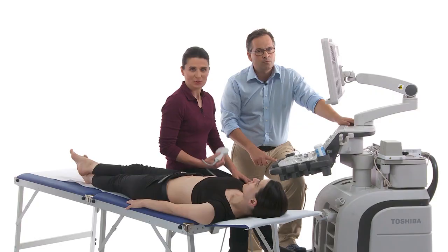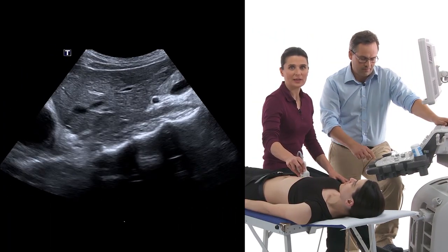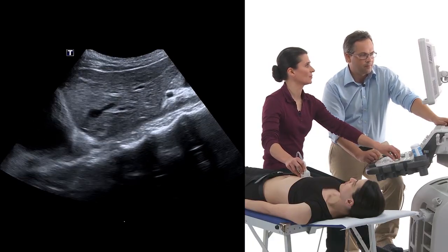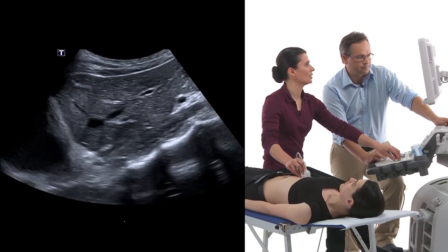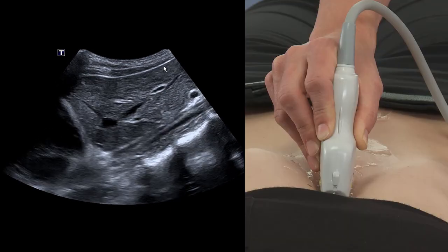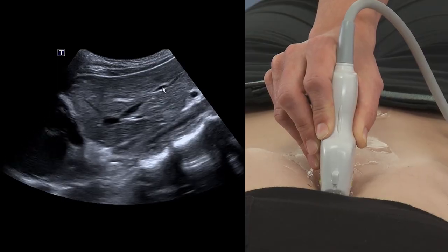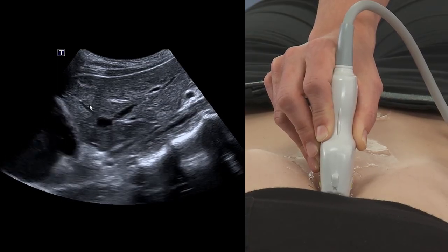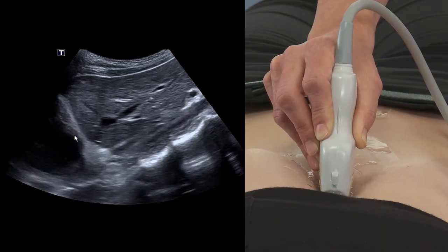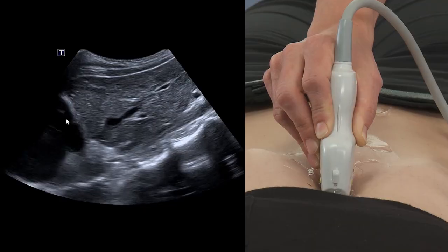We start with the longitudinal epigastric view. Place the transducer in the midline in the epigastric area. Adjust our picture and can easily display the left liver lobe over here. So we can see branches of the portal vein and over here liver veins, diaphragm. Something moving over here. The heart.